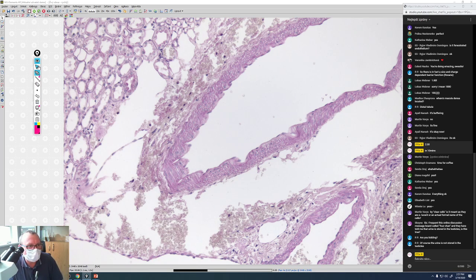So let's go on. I think that we can leave this slide. Of course, if you have it in examination, you can describe the same things as were described in the previous slide. So don't think that the hematoxylin eosin kidney needs a long description, and PAS kidney needs only short description of PAS positivity. I think that all structures, all tubules are here recognizable, like on the previous slide.